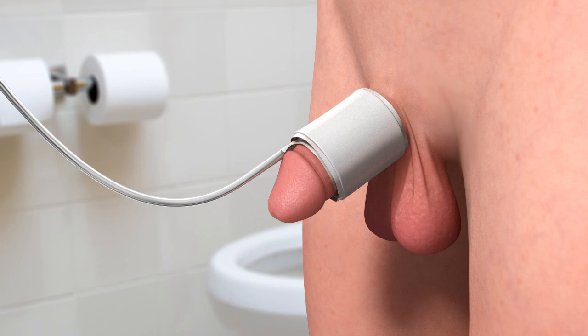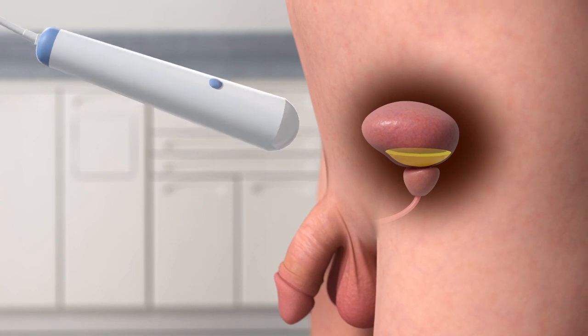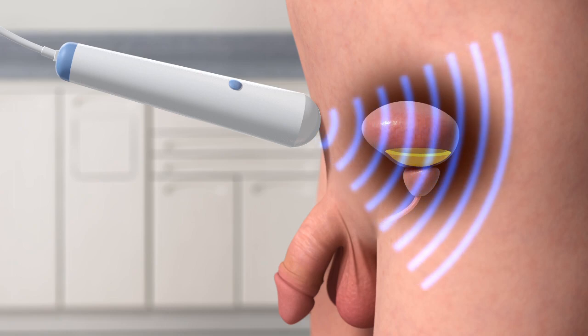The pneumatic cuff and surface electrodes are then discarded. An ultrasound is used to determine post-void residual, and this data is noted in the system.